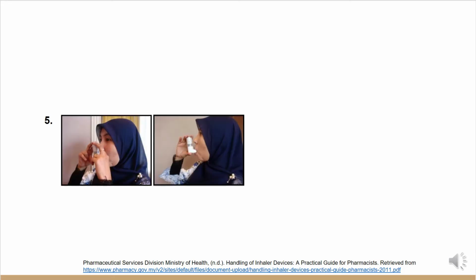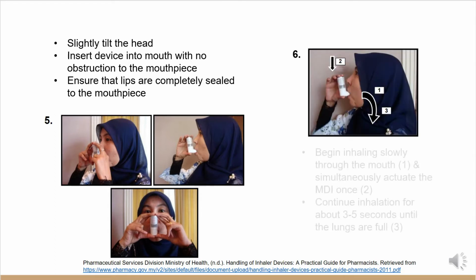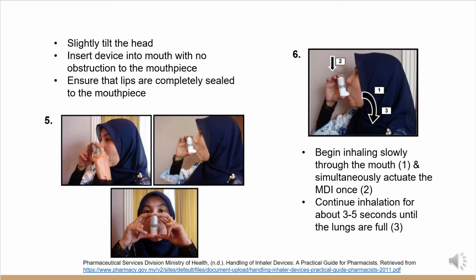Then, they need to slightly tilt their head and insert the device into the mouth with no obstruction to the mouthpiece. They also need to ensure that their lips are completely sealed to the mouthpiece so that there will be no leakage. However, please do not bite the mouthpiece. And then they can begin inhaling slowly through their mouth and simultaneously actuate the pump once. And continue inhalation for about 3 to 5 seconds until the lungs are full.